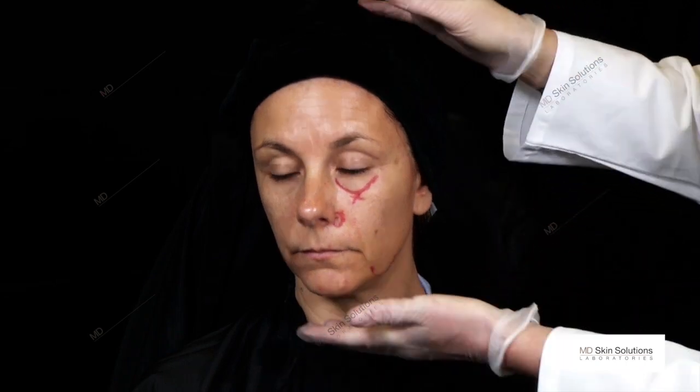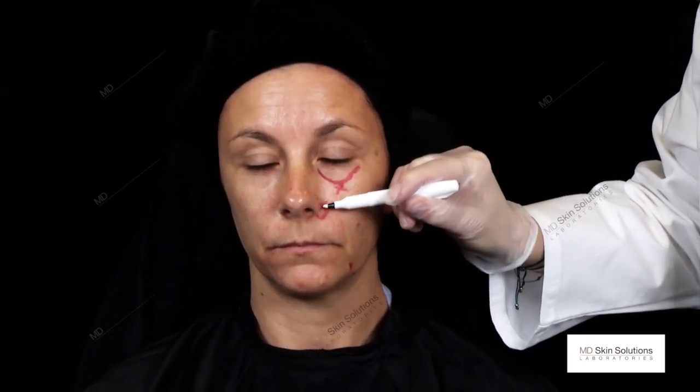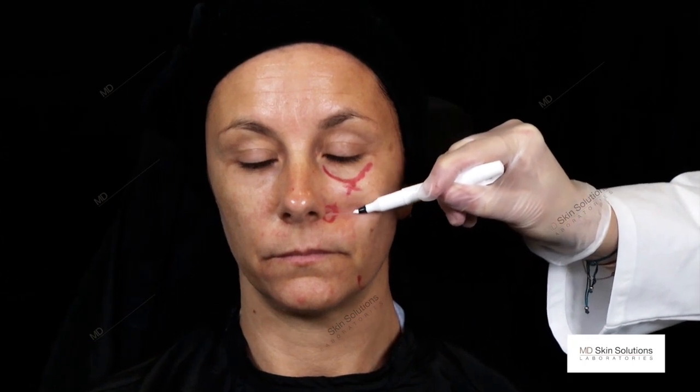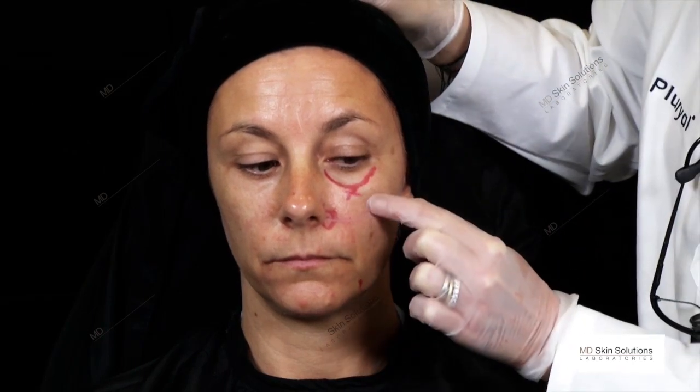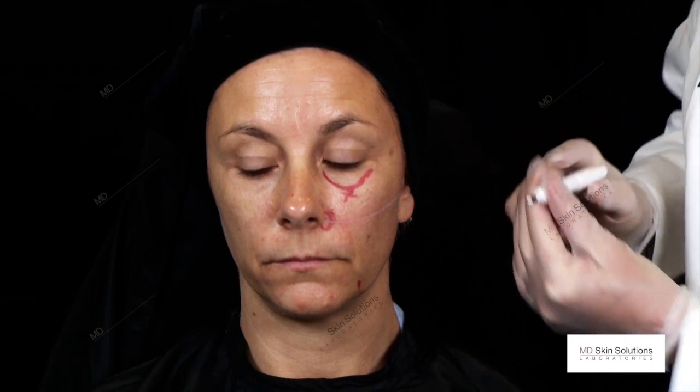The second lines are done to find the entry points. There is one line which comes from the alar triangle and goes to the tragus. This line tells me to stay deep with the injections above this line, whereas if ever she was wrinkling here, we stay subdermally below this line.